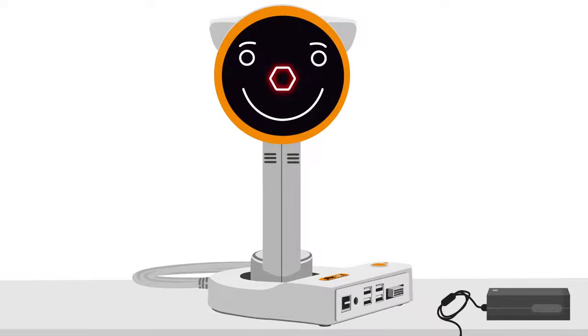The camera lens is located directly behind the nose of the smiley face. If the child is old enough to understand instructions, they should be asked to look directly at the nose of the smiley face. Avoid the use of additional fixation aids. Having the child look directly at smiley's nose will produce a good, valid screening result. Any distractions should be avoided while screening.